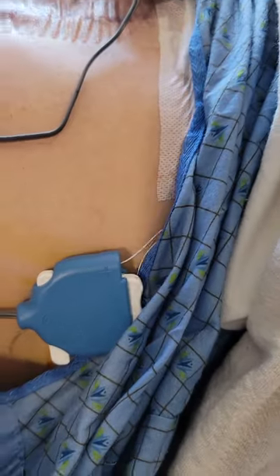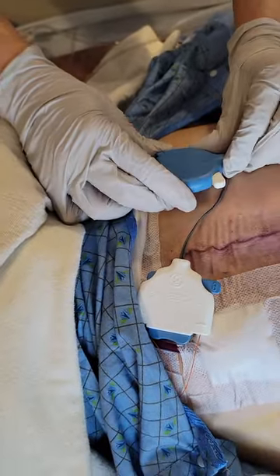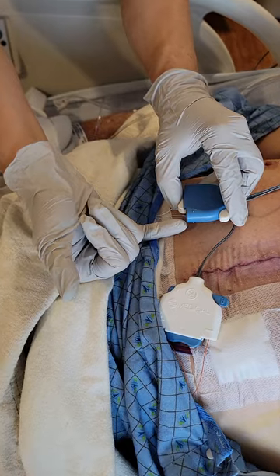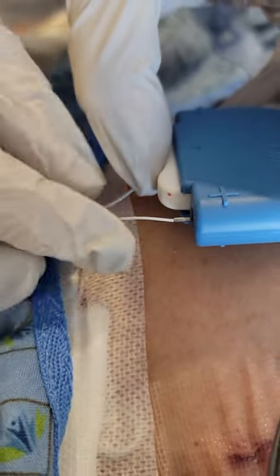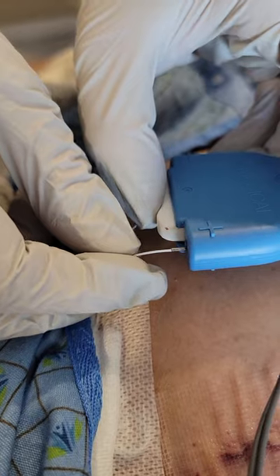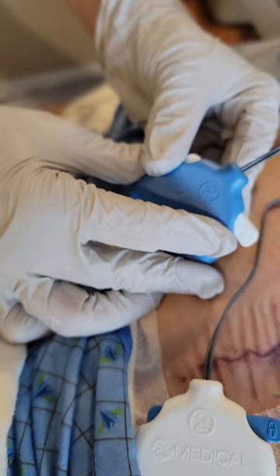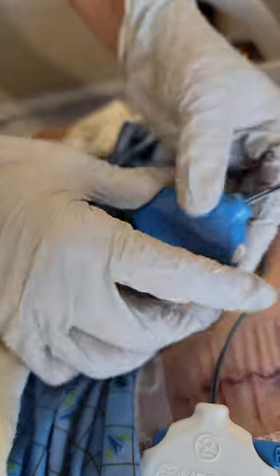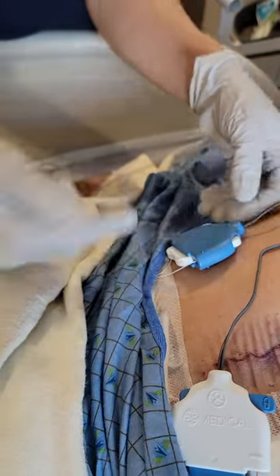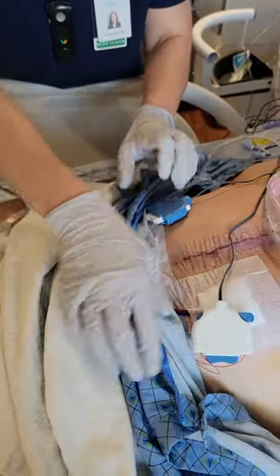On the patient, you want to make sure that these connections are tight. What happens sometimes is these lock and then unlock, and you have to push this button and the wires come up. Can you see the silver part? When it's up like that, a lot of times this is getting bent and then ripped, so just make sure you push on this and it's all the way in. See how it's unlocked — you want to switch it to locked, so you can't push on that and the wires won't come out. It'll protect that connection where they're getting torn sometimes. That's what you do at the patient's site as an assessment.